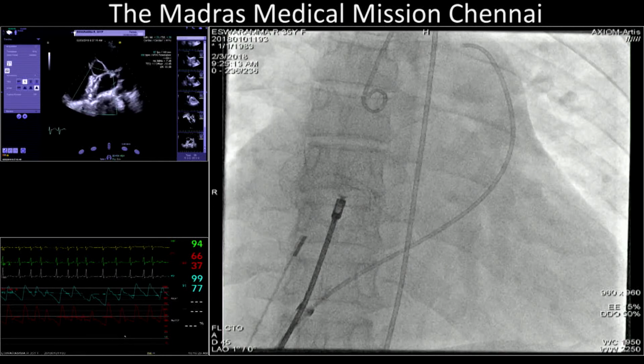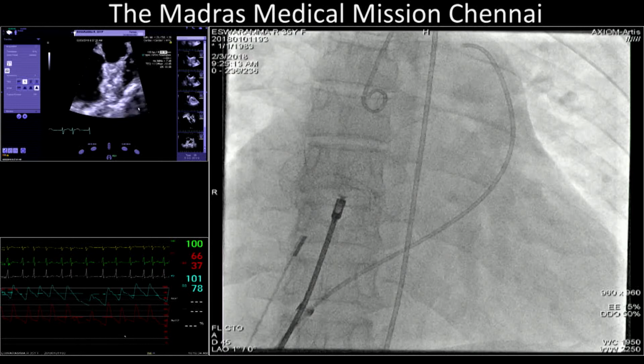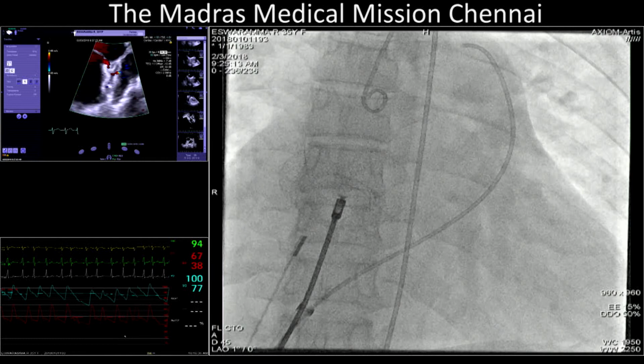Dietmar, you are very emotional and I appreciate that, but still there is no need for this fenestration. Well, I think there is. Yeah, this argument will carry on. We'll never have a solution to it.